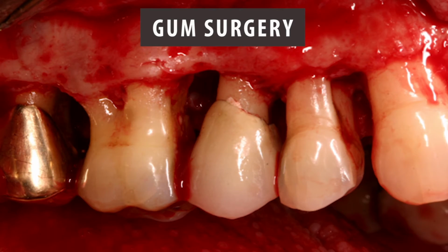The main idea behind gum surgery is, rather than reaching into these pockets and cleaning by feel, what we do now is we get the patient anesthetized again, but this time push the gum tissue back out of the way so that we can directly visualize the root surface. From there, we remove any remaining bacterial aggregations that are on the root, and then often in bottom teeth move the gums down, and top teeth move the gums up, thereby making a deep pocket shallow.